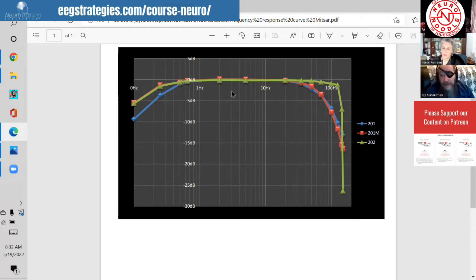And how you feed it back is crucial as well. So different feedback groups end up having to be very careful, not only about what amp, but what kind of electrodes. If you're doing slow cortical potential or infra-low, infra-slow training, and you're not using a silver chloride or a DC-resistant electrode, silver chloride's the classic, but there's carbon fiber and there's silicon electrodes that are also DC stable. But they're rare. Mostly research labs use those.